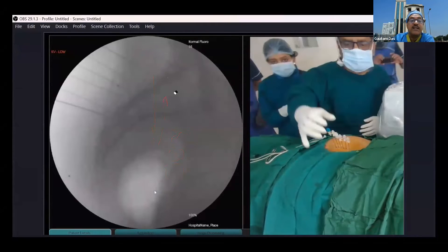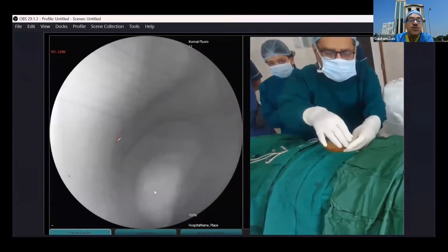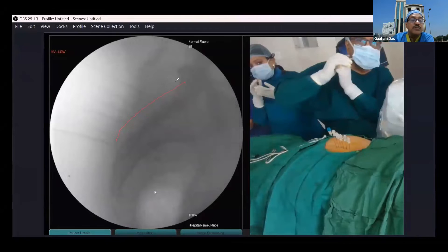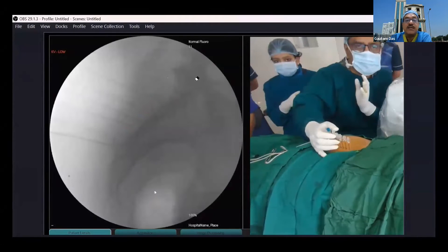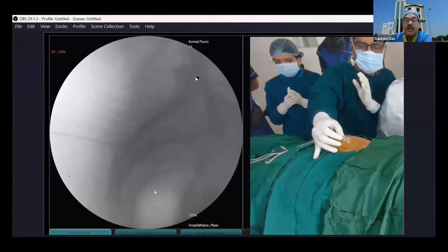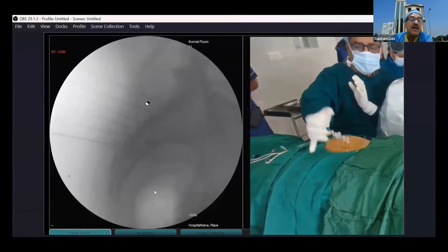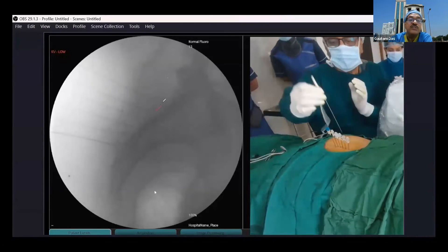We will first check with the lateral view. In the lateral view, your needle should not cross the posterior sacral plate — you should not go into the sacral canal. We have to check both with the lateral view and the AP view. The needles should be almost parallel and the distance between the two needles should be approximately one centimeter.